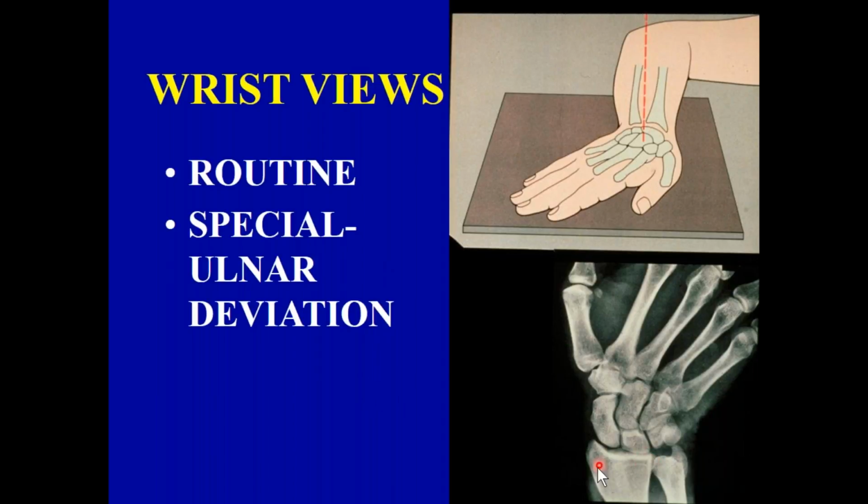take your calipers and measure the wrist here, you would get, let's say, 8 centimeters if it's a big wrist. If you put the calipers at the head of the third metacarpal, you're going to get a different measurement. And if you use the technique factors for this, the metacarpal area is going to be too dark, overexposed.